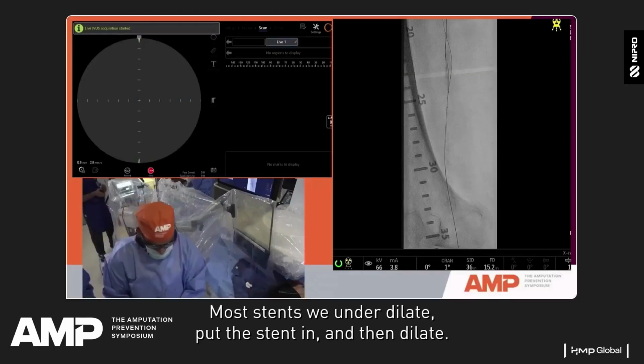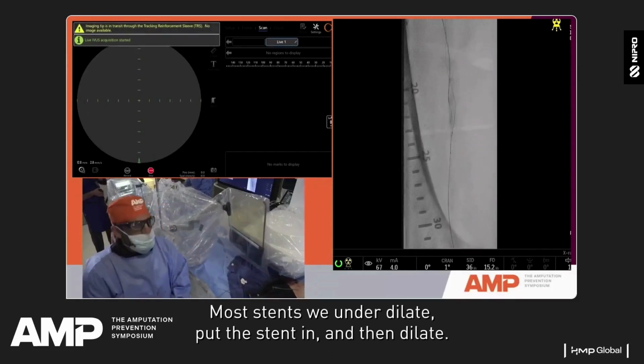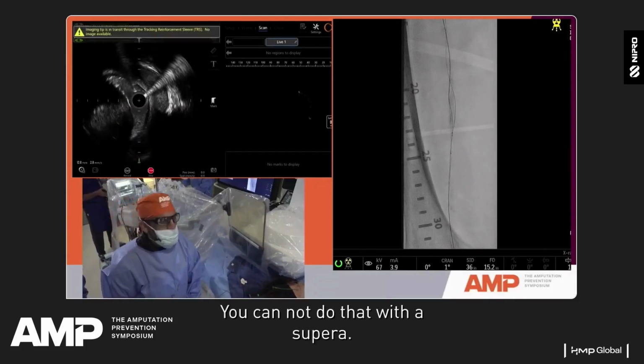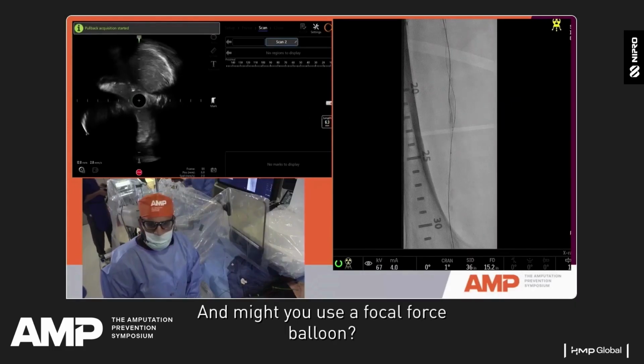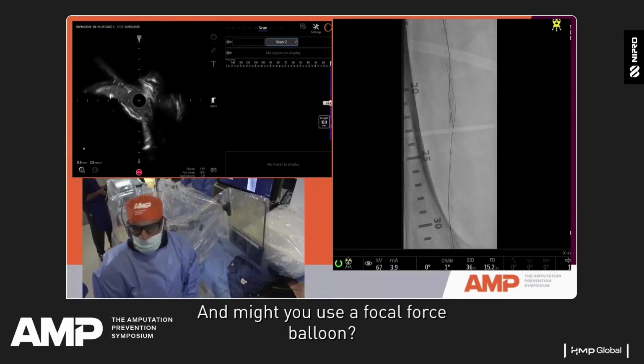Most stents we underdilate, put the stent in, and then dilate. You can't do that with a Supera. You must prep the vessel well first. And might you use a focal force balloon?